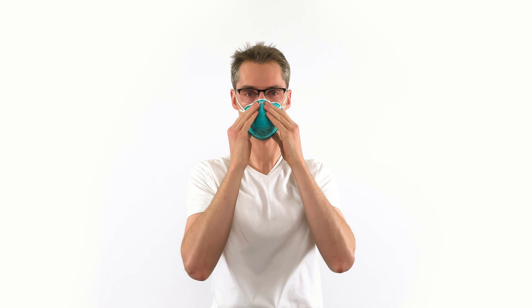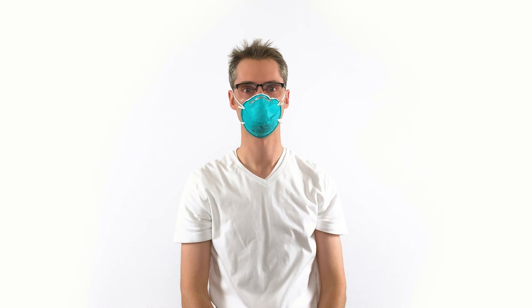Remember, comfort is important too, though less so. Check for a good seal. Place hands in front of the mask and inhale quickly — expect the mask to tighten around your face as you do. Then place both hands completely around the mask and exhale quickly.